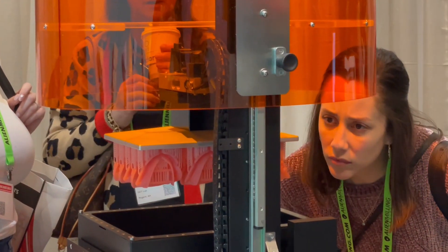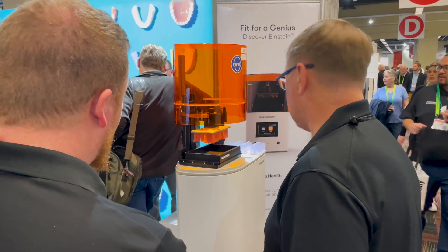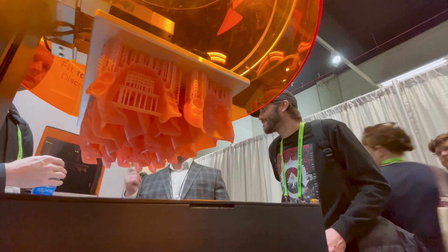This new hardware release delivers a larger build platform which allows for greater productivity in a lab setting. This gives you unparalleled productivity relative to our own tools and all the other DLP tools out on the market today.